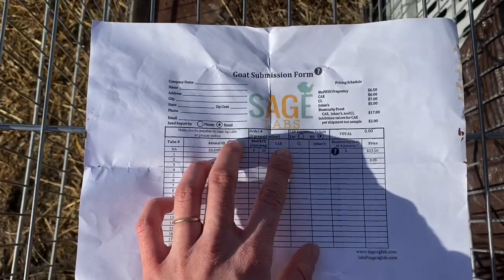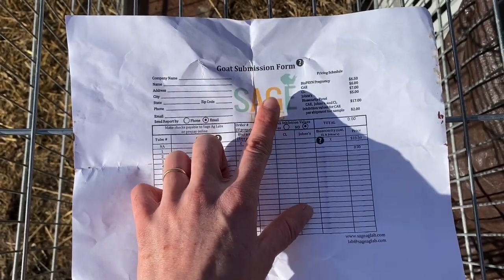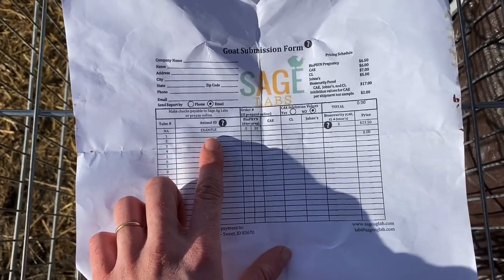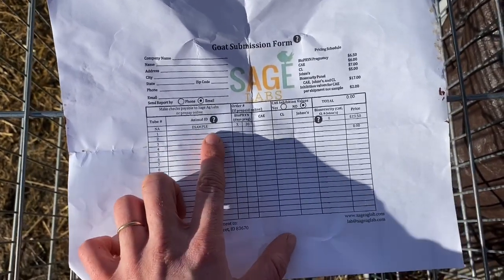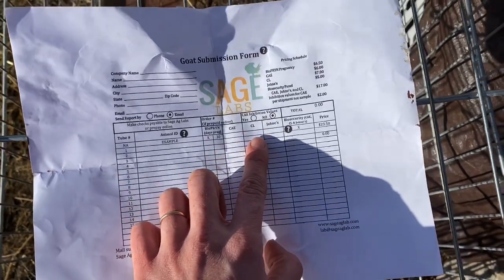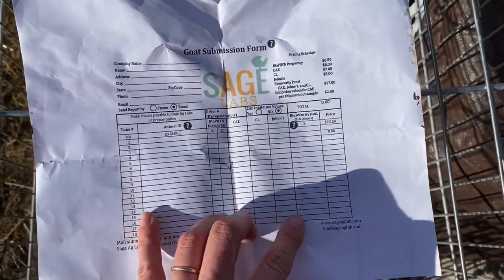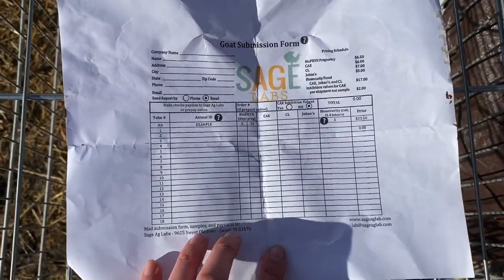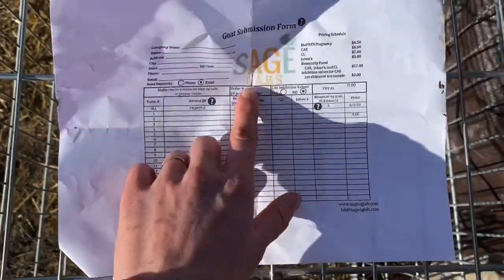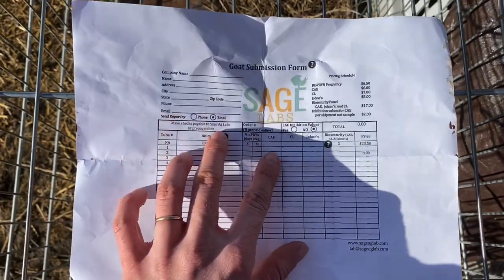Once you've got your blood sample, you just need to go on the Sage Labs website and get the submission form for whichever type of animal you're sending in samples for. You write the name here — whatever name you wrote on the red top tube — the number of days pregnant, whether you're testing for CAE, CL, or Johnes. The prices are up in the right hand corner, and then send in a check with it or you can prepay on the website. It has the address of the lab down here, and I'll put the link for Sage Labs down below.